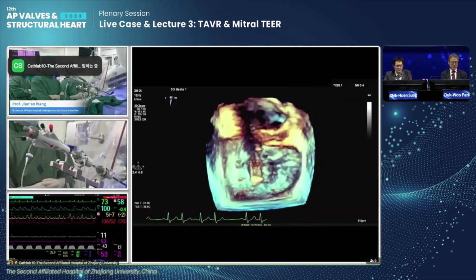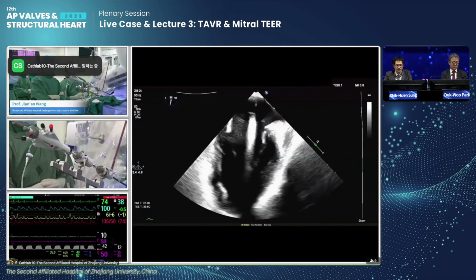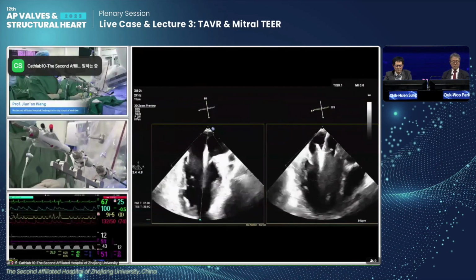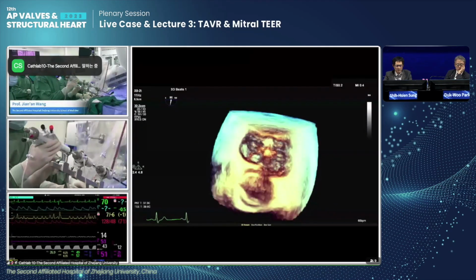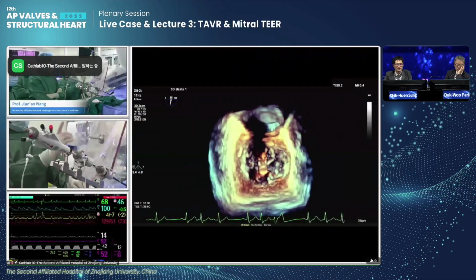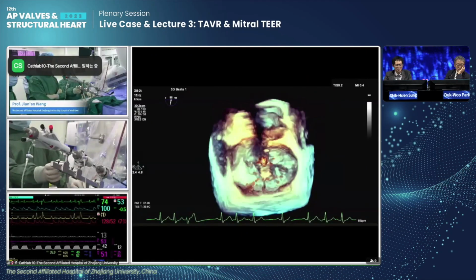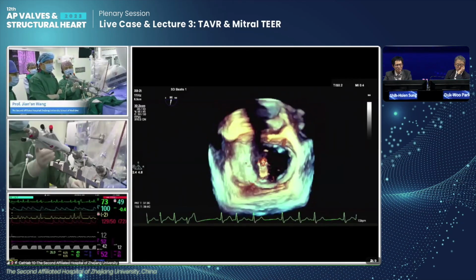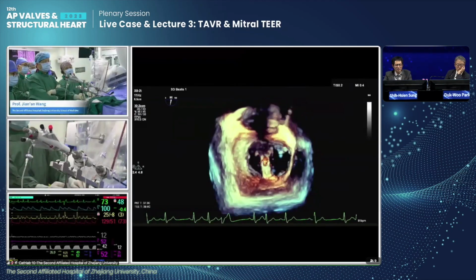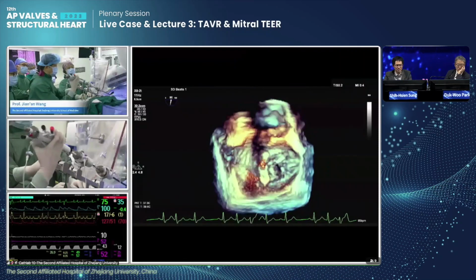The alignment may not be well imaged, you cut off one arm. The left atrium is small, so the imaging plane is insufficient. It's an angle problem. Move closer to the valve and you may get it. It's imaged now. The anterior arm is not fully open or imaged well. I'm just worried about the orientation. Probably open it a bit larger, around 12 o'clock. It needs a big clockwise rotation. You can close it and rotate clockwise.